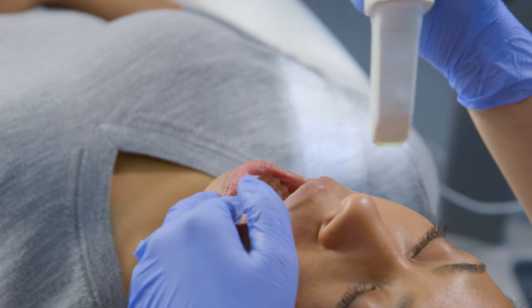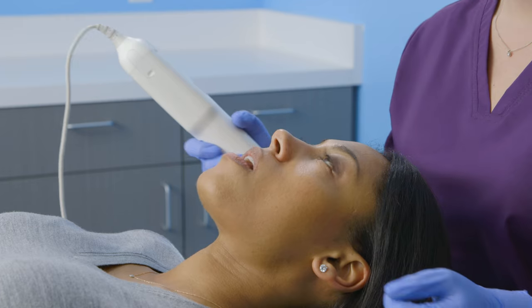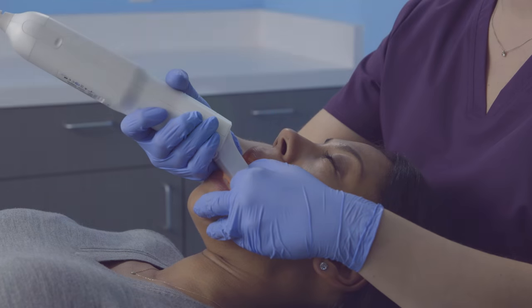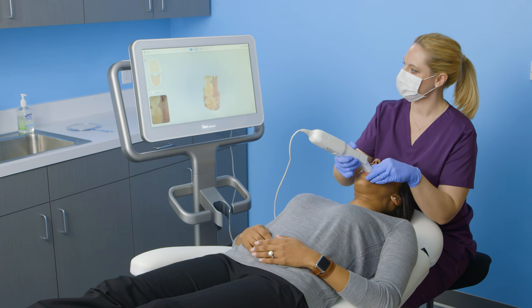I always rest the wand tip gently on the patient's teeth. I never hover. I only need to press and release one of the side buttons to start and stop the scanner. I keep the scanner on while I scan an entire arch.